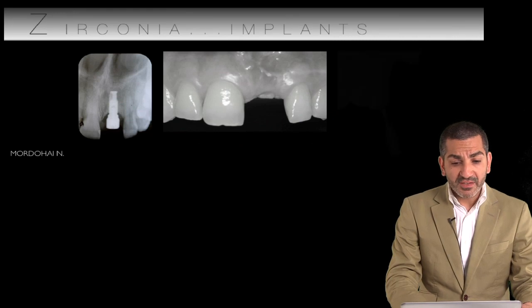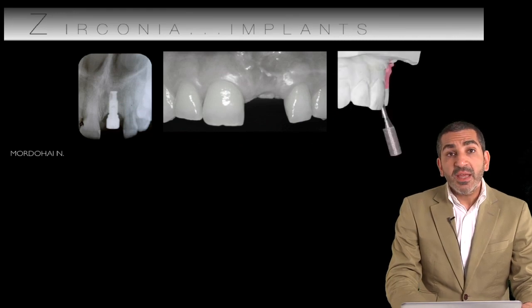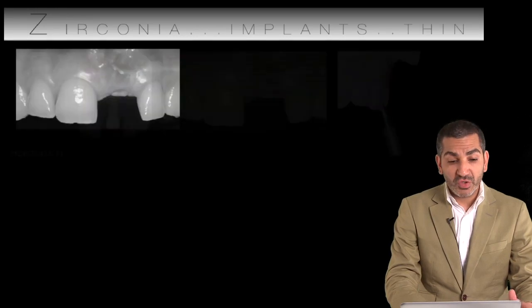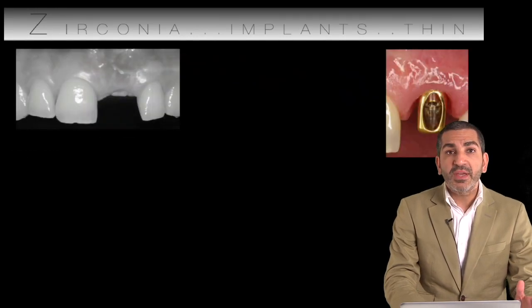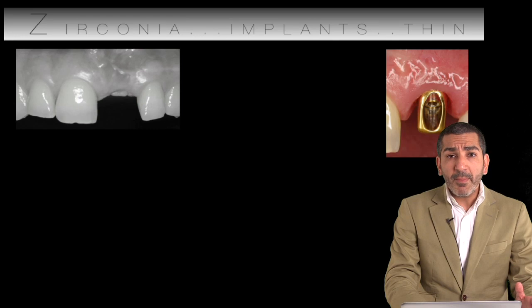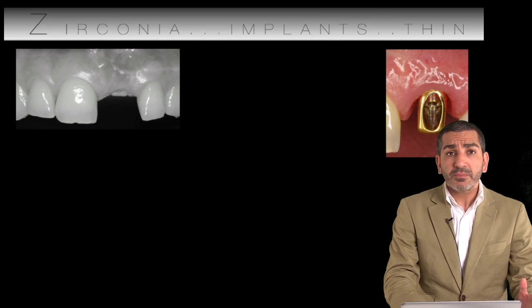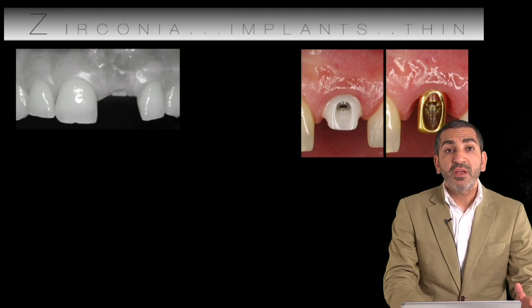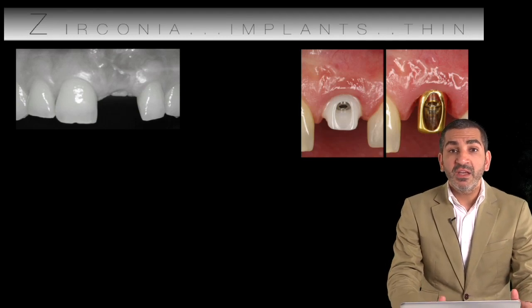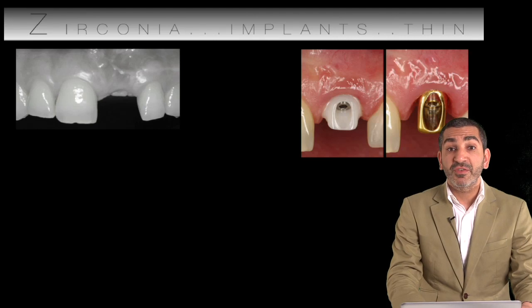So the patient again has lost another central incisor, implant angulation is quite facial, and the tissues are extremely thin. So we can see we're getting into a sort of difficult arena in terms of restoration of these patients. Patient with a gold abutment, and you can see the abutment color through the soft tissues. Patient now has a zirconium abutment in there. Again, we can see the zirconium abutment through the soft tissue.